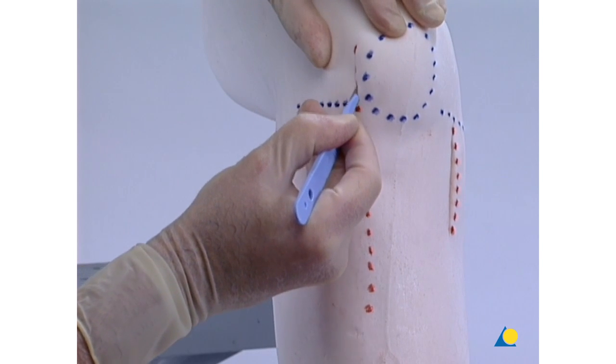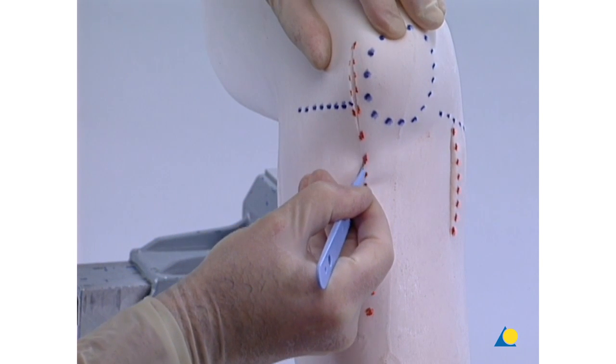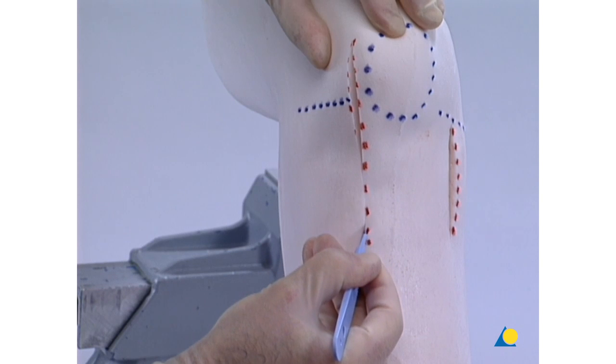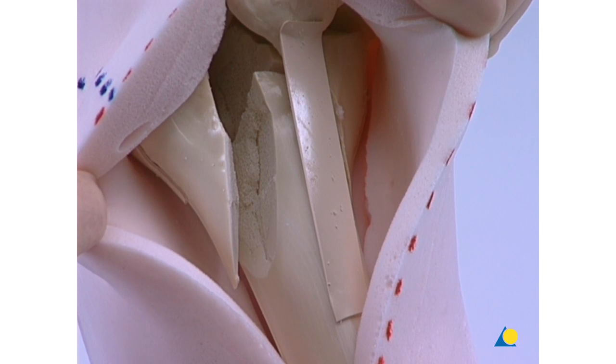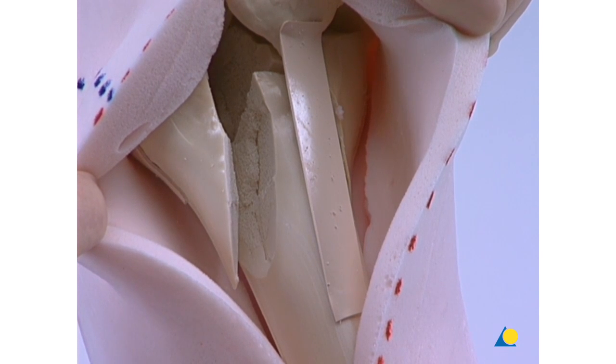For the surgical approach, a skin incision is made running laterally to the patella and tibial tuberosity. It proceeds directly down to the bone without separating the tissue layers.